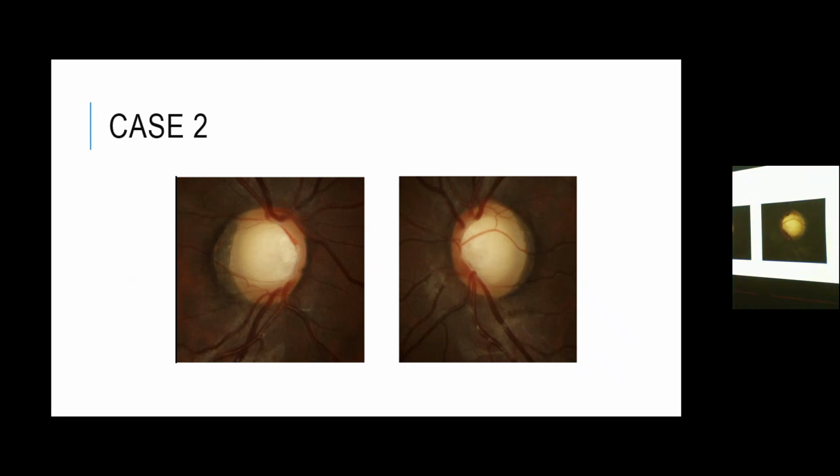The picture of the left eye shows a cup disc ratio of 0.75. Same thing with the vessels. How about the rim? What do you think about the rim? Do you see any focal changes, notching, or any glaucomatous signs other than the cupping? It also has some peripapillary atrophy here. It does look tilted a little bit. The vessels are fine. But the rim, you can see it's roughly symmetrical here.